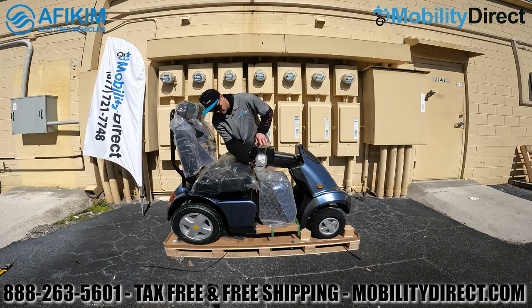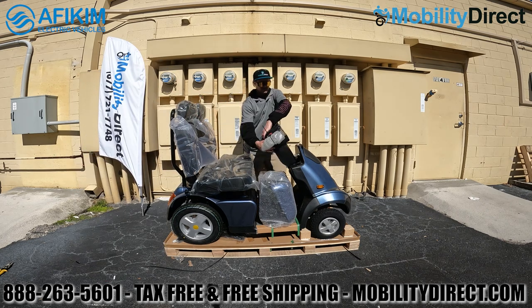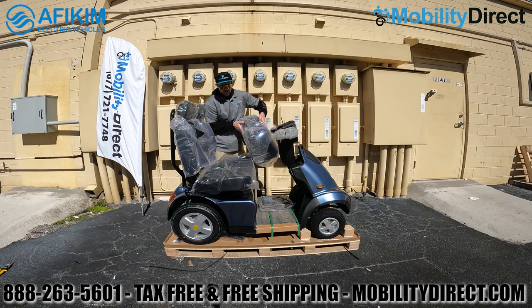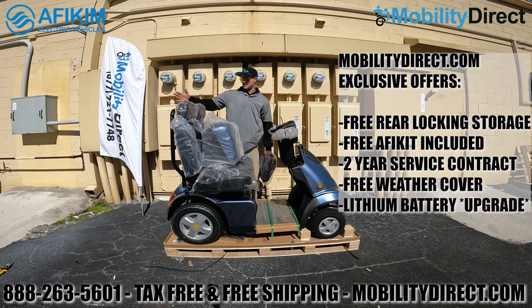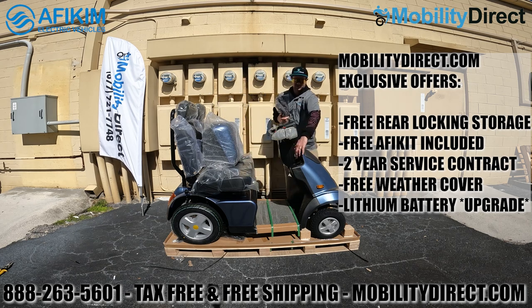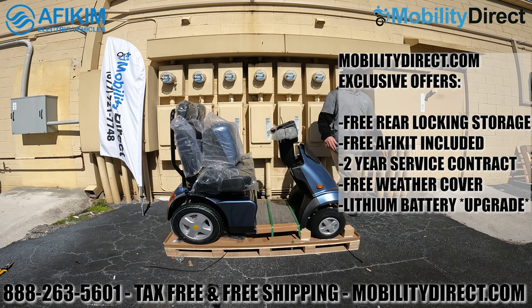On the tiller assembly — also known as the handlebar assembly — there is a tab towards the right side that you need to push down in order to lift the tiller. That tab is used to adjust the tilt angle of the handlebar assembly. Once you do that, you can expose the rear cargo locking storage. As an exclusive offer from Mobility Direct, we include an Afikim kit which includes a cleaning rag, a keychain, and a weatherproof cover.